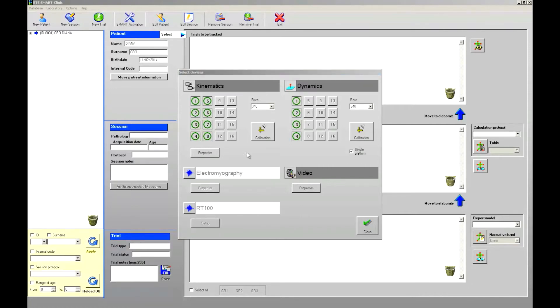On the kinematics box we have displayed all the cameras with their ID number. They are usually all active, meaning they are all displayed in green color. If I select a given camera with the left mouse button, I can disable or enable it. Green is for enabled and red is for disabled.